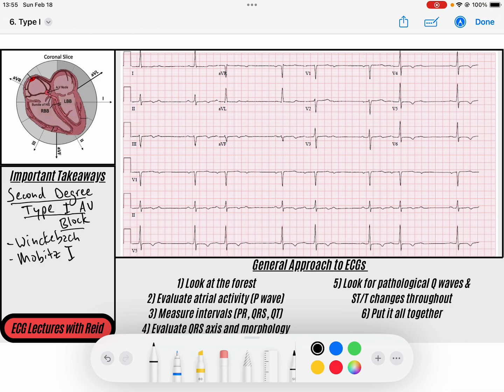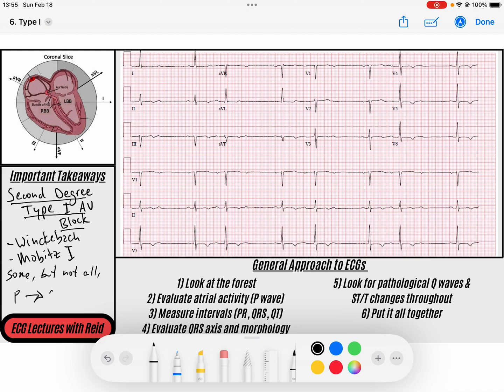Second degree AV blocks are kind of the middle block. We have first degree, second degree, and third degree. Go ahead down to the description and download these PDFs of these ECGs if you want to follow along. Second degree AV blocks means that, in layman's terms, some but not all P waves conduct to the QRS complex. That's the general definition of a second degree block. But a second degree type 1 is a certain pattern.